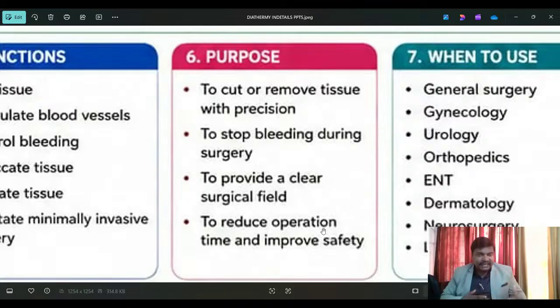Before any surgery, the doctor will tell all the requirements and the technician will make everything ready. If anything gets a problem at that time, the technician informs the biomedical engineer, because the technician is not able to do these services. The technician only operates the equipment, sets the settings, and makes it ready for the surgeries. If anything is not working, he cannot do anything.